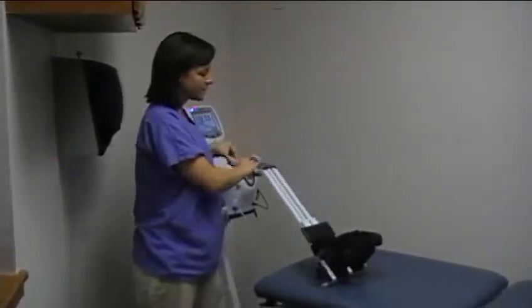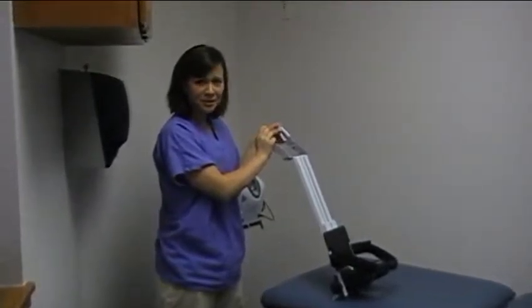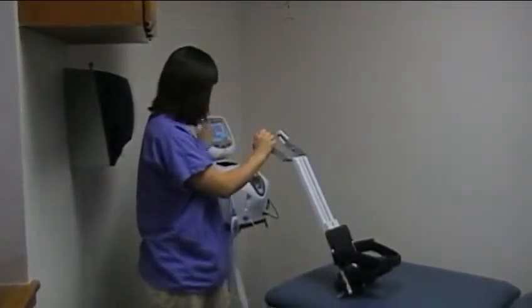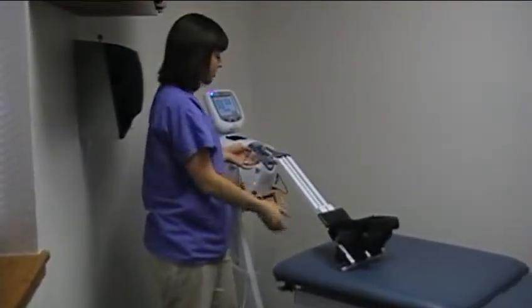This is for cervical spinal decompression. This is the add-on that you're going to put onto the main unit to be able to do cervical decompression.